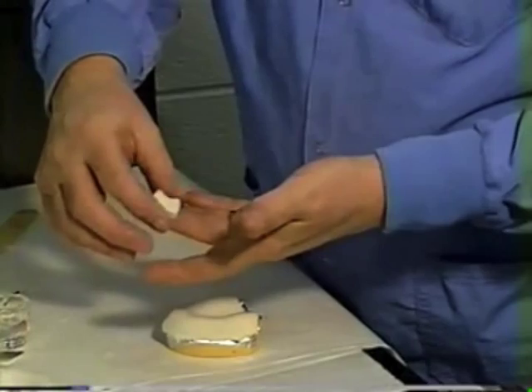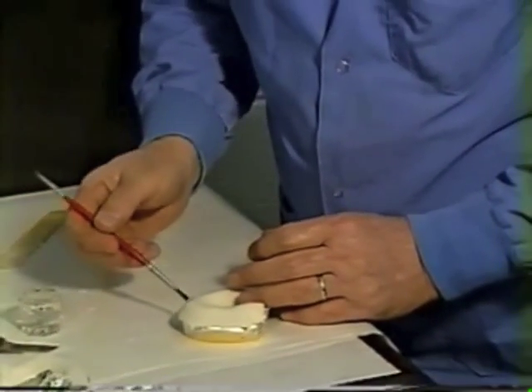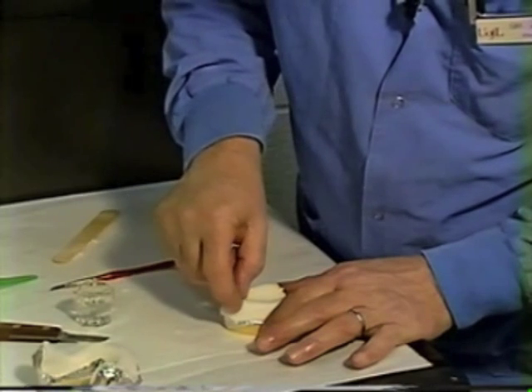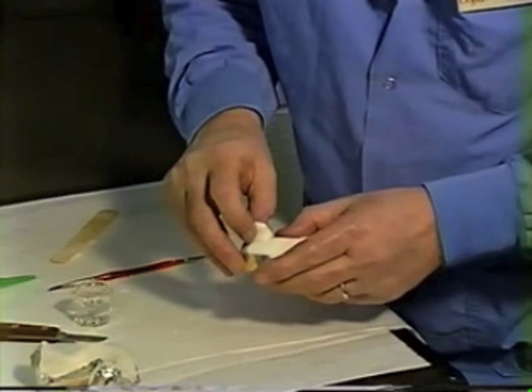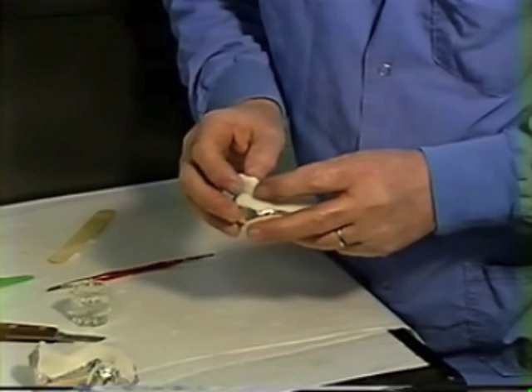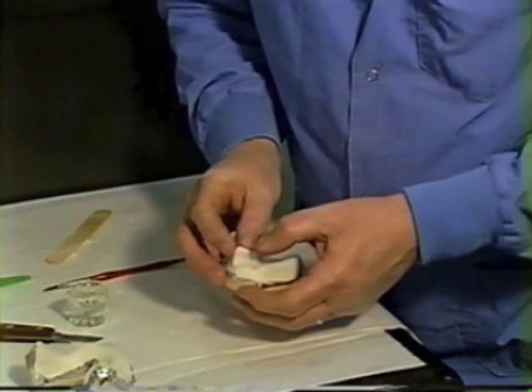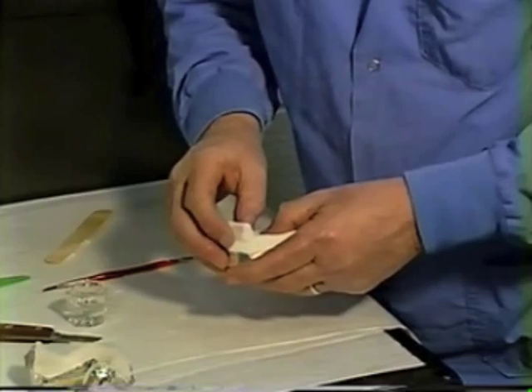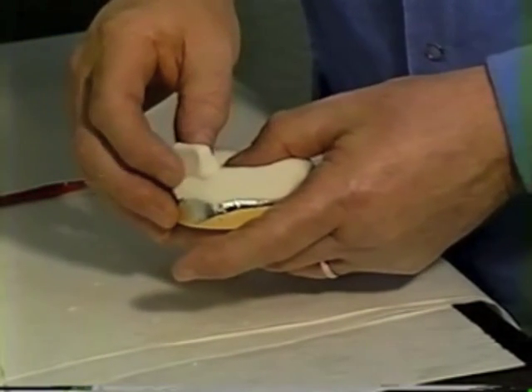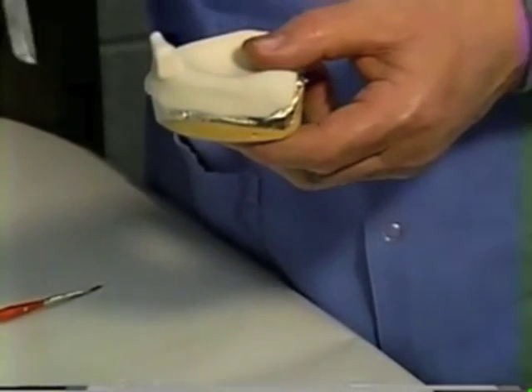Before adapting the handle to the tray, wet the area with a little monomer and wet the surface of the handle. Adapt it to the tray in the general area where the incisors would be. You want it to simulate the position of the incisors, and you also want the handle to be somewhat indented in the middle so that when you're making impressions you can hang on to it. If the handle is too smooth and slick or rounded off, you'll find you can't hang on to it.